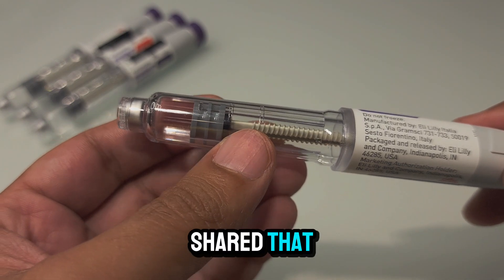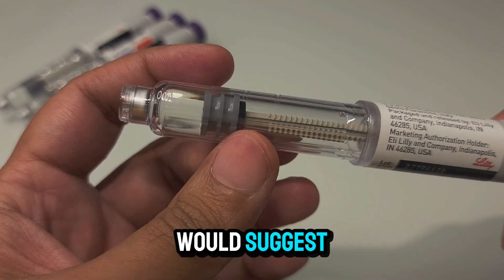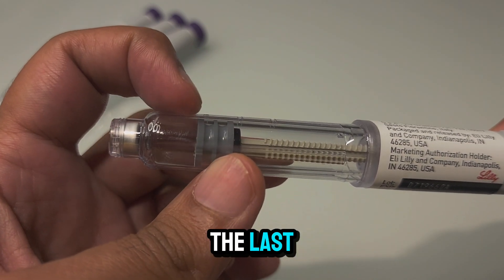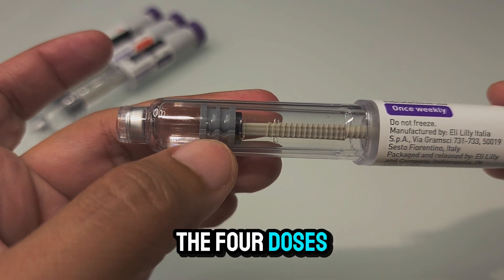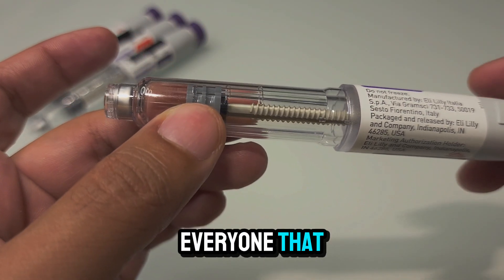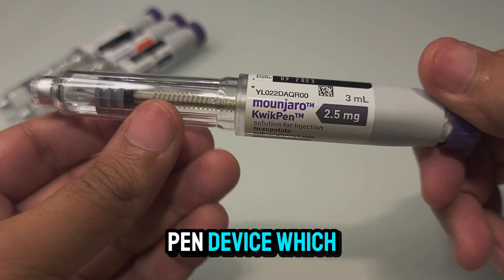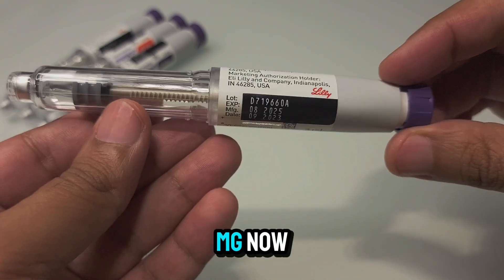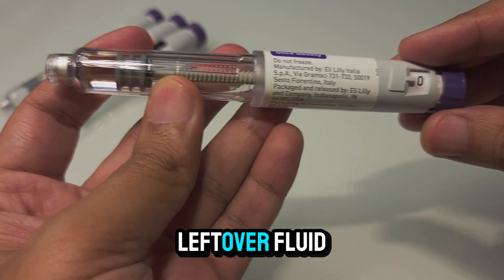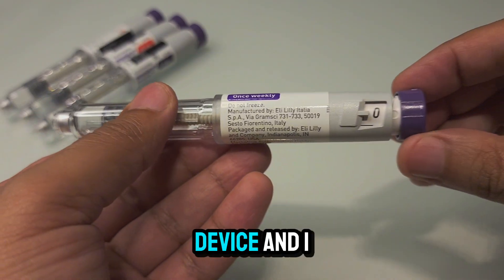In my previous video I had shared that the engravings on the glass container indicate that once you reach the last engraving — the third one — you have already administered four doses. I want to reassure everyone that you have not missed your fourth dose. This particular pen device is supposed to administer four doses of 2.5 milligrams. The remaining leftover fluid is sadly a waste and is not designed to come out of this pen device.